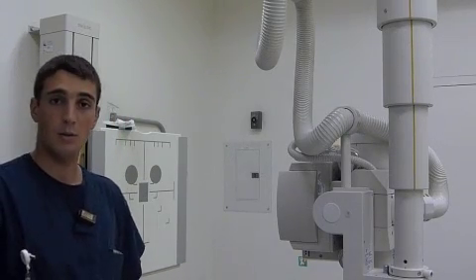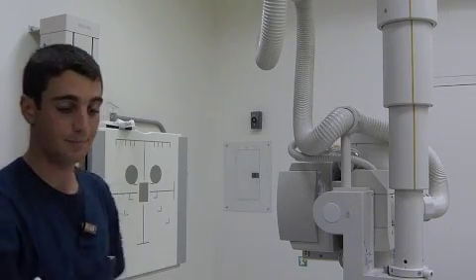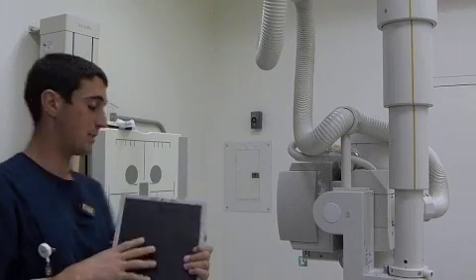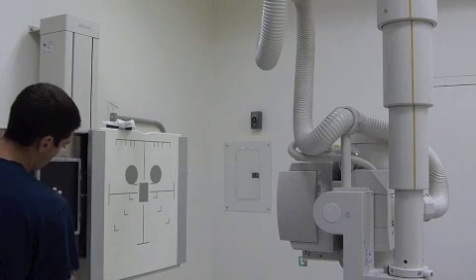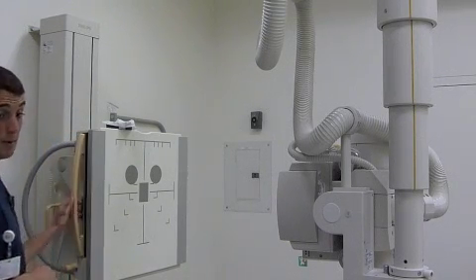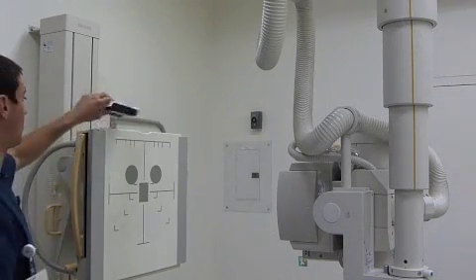Alright, I will now be performing the PA axial Caldwell with the head tilt to 15 degrees. We'll be using the 8x10 film, and I will be using the Bucky. I will be using the sponge to help with the head tilt.